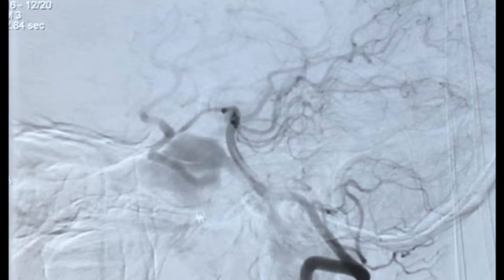So now once we have decided the site of fistula and it looks like this, there are multiple options for treatment. The first thing, we can go from the carotid and we can do a coil embolization. Second thing is we can go into the fistula and do a coil plus Onyx injection. And then the third option will be going here and putting a detachable balloon and embolization.